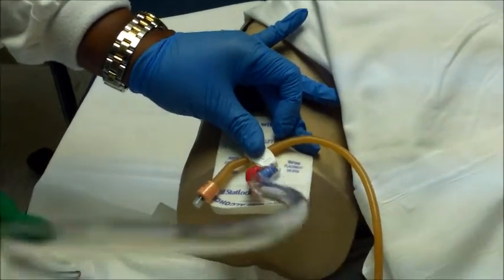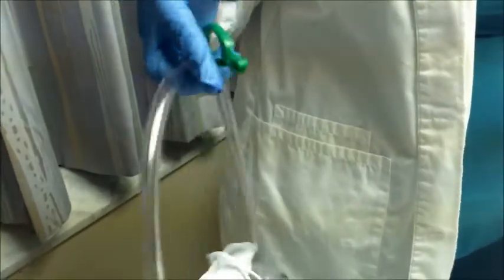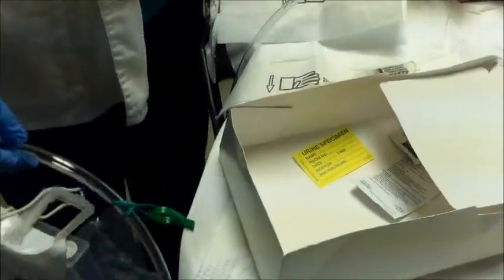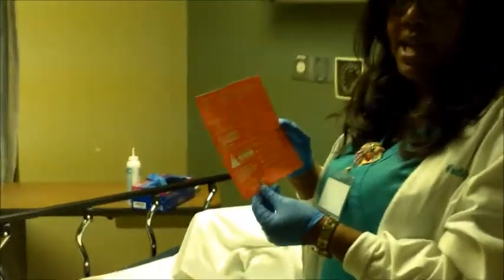I want to make sure that the Foley, this here is a bed clip. You want to attach it to the sheet to eliminate loops in your Foley to help it flow better. And you want to make sure you attach the Foley catheter at the foot of the bed. And this is part of the documentation of a Foley catheter and placement.